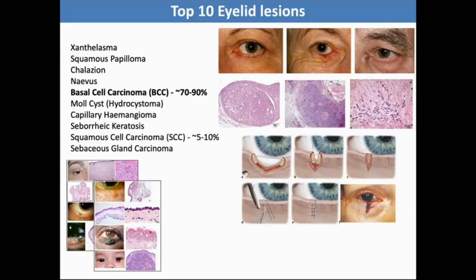More often than not, an eyelid wedge resection is performed, and the specimen is typically sent with a marking suture for orientation purposes, so that when giving out the report, you can say whether the medial, lateral or inferior margins are clear of tumor cells.